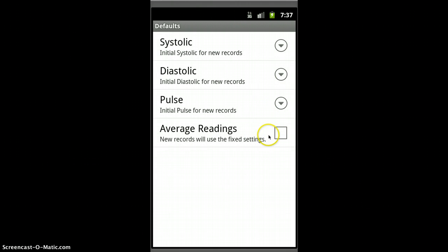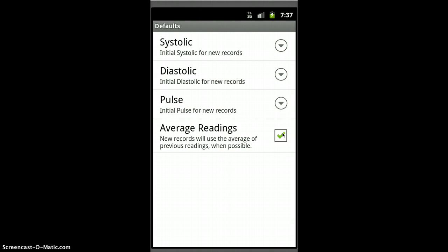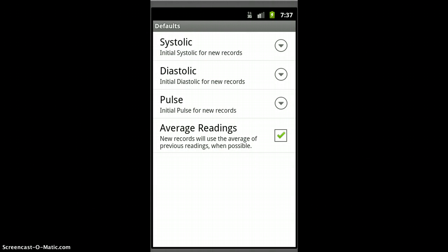And then finally, you can do the same thing for your pulse. And then this is new also, this is the average values. What this is, is once you have some data, once you've collected some values, then it can average them. Let's just put that on there because I have some data in there.